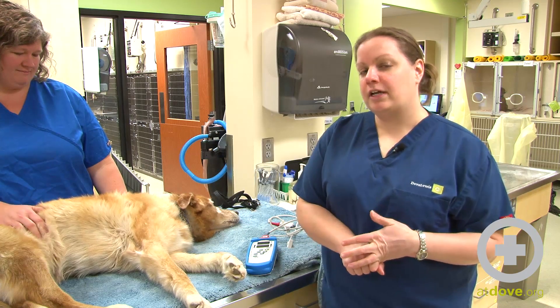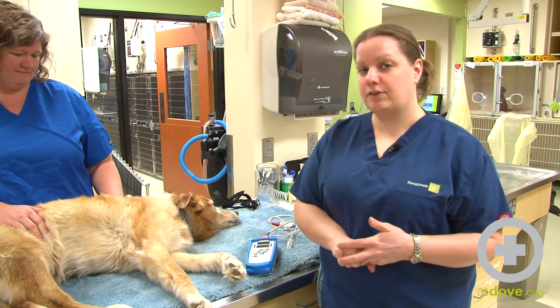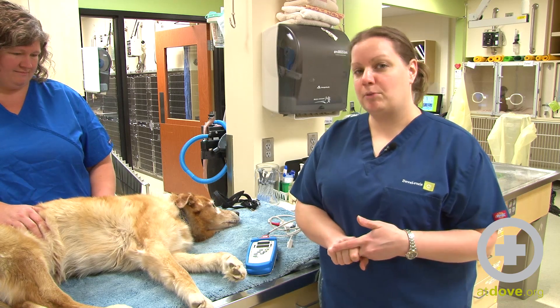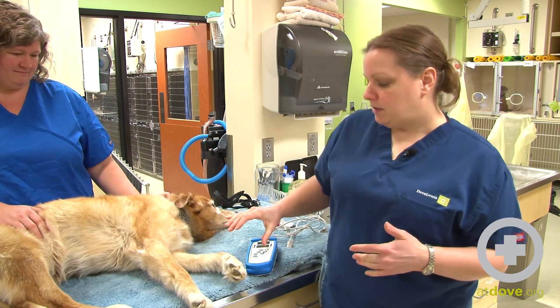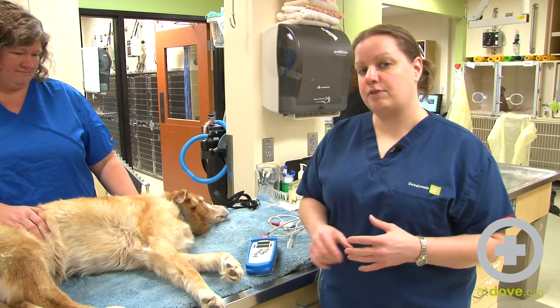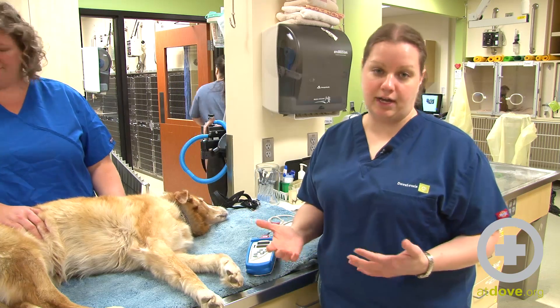Animals that are icteric or very anemic — you're going to have a difficult time getting a good Pulse Ox on them. Also patients with very poor perfusion. We are going to be using the periphery in order to get this Pulse Ox, and so if they're not perfusing their periphery very well, you're going to have a difficult time.